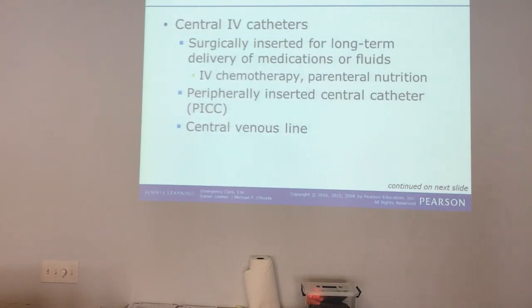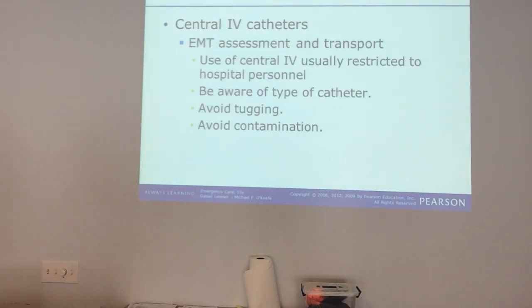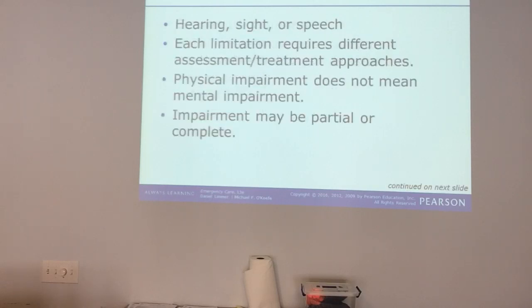Central IV catheters are surgically inserted for long-term delivery of medications or fluids, IV chemotherapy, parenteral nutrition. They have PICC lines, peripherally inserted central catheters, or central venous lines. These are implanted ports. A lot of times they'll get infections at the site. You've got to be extremely careful. I've accessed several ports in the ER. I've implanted the ports, but they can get infected very easily, okay? So use of central IV usually is restricted to hospital personnel. Be aware of the type of catheter and avoid tugging, avoid contamination.